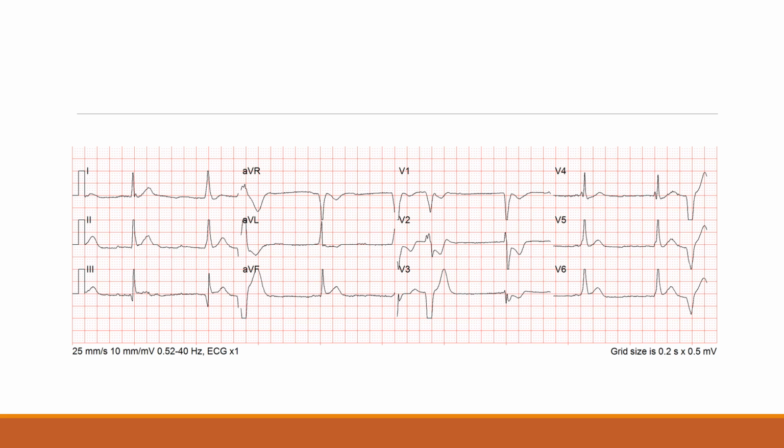If you're looking at V1 and V2 and trying to think, oh wait, eyes over there, well, A, it's silly, and B, there are just way more effective ways. I've had students who memorize it who can tell me, oh, V1, V2 is the S, so that's septal, but they don't understand what that even means, or what septum is, or where that is in the heart, or how that correlates with the anterior, lateral, or the vessels, or anything.